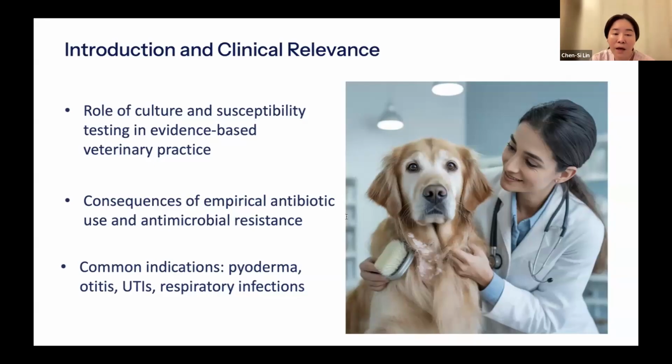By adopting proper bacterial culture and susceptibility testing more consistently, we not only improve outcomes for our patients, but also contribute to global efforts in antimicrobial stewardship. The data we collect helps build local antibiograms, guiding practitioners toward more effective first-line choices while preserving critically important drugs for cases where they are truly needed.